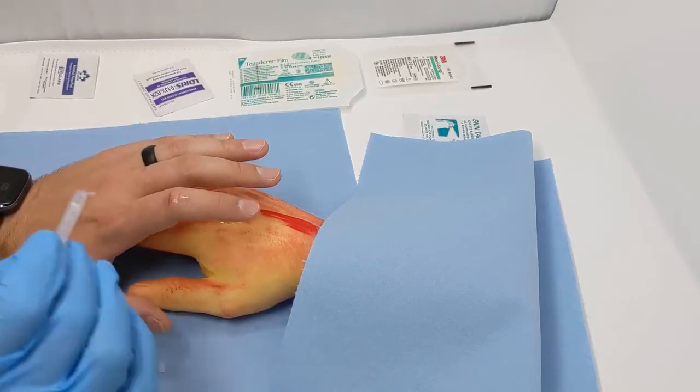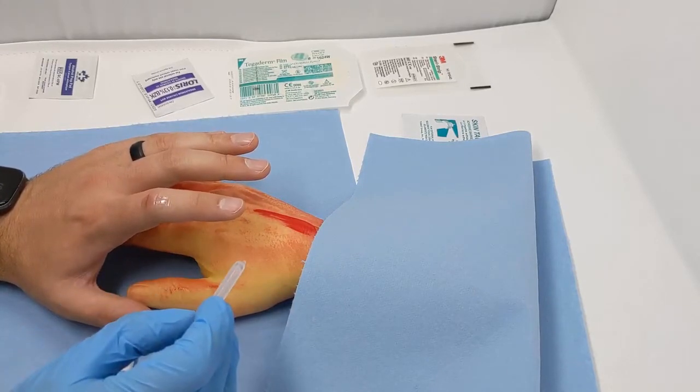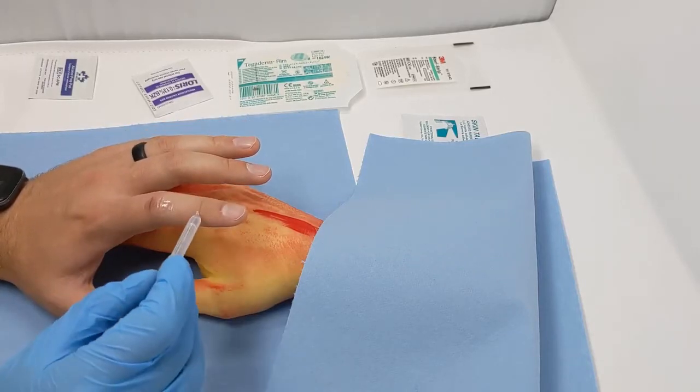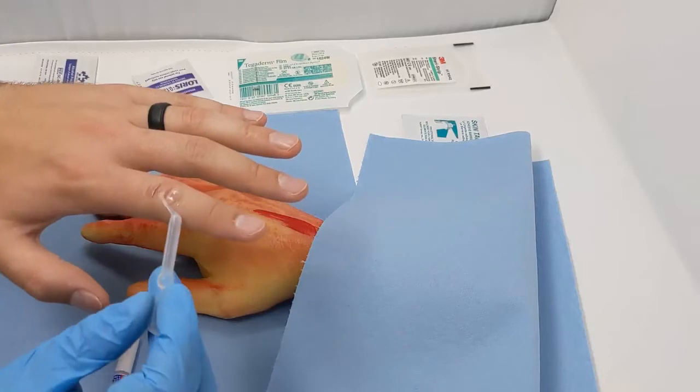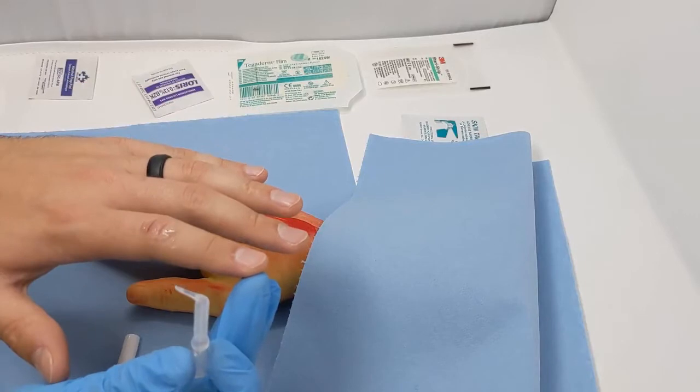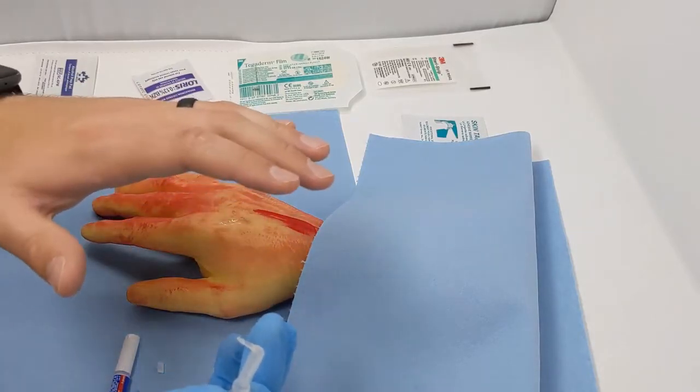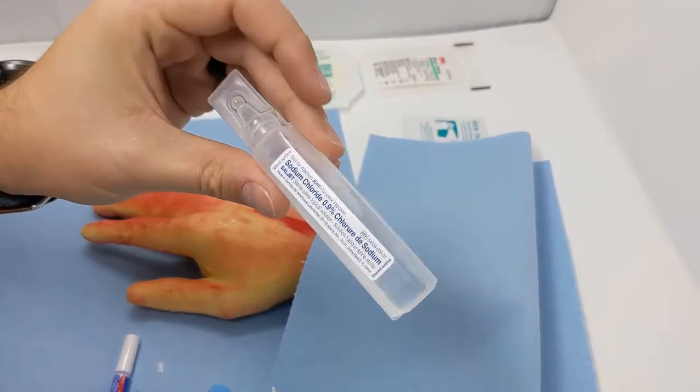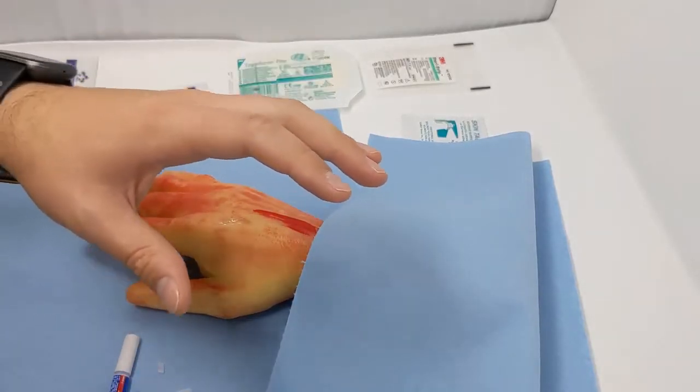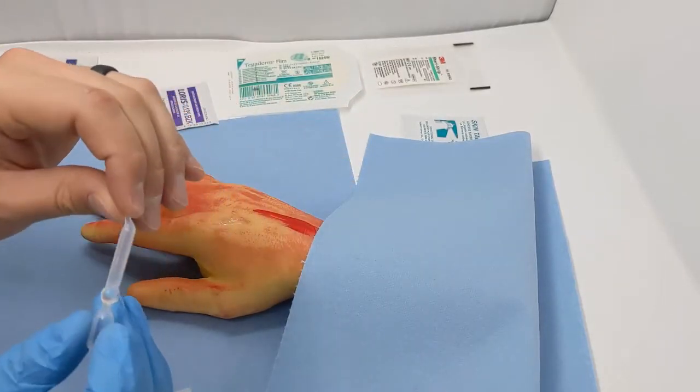This would be for areas like a small knife gash that's not super deep, around fingers, maybe a facial laceration that's not very deep, where we want to approximate the skin well and bring it back together. We can glue it to hold it there, and this will keep the wound together and prevent infection from getting in. But you really want to make sure it's very clean before you do that. Cleaning with some saline, water, BZK swabs, really making sure it's clean before you close it. If you're concerned that it's contaminated and not clean, we would not do this gluing.